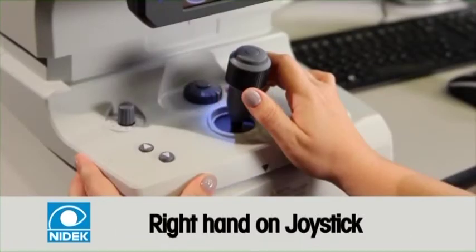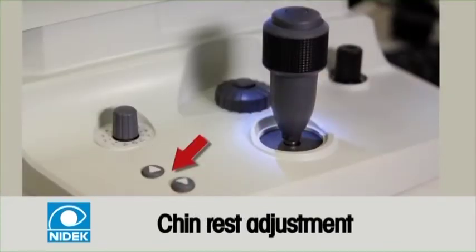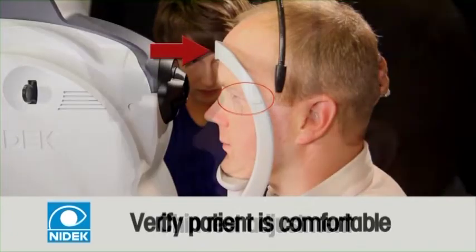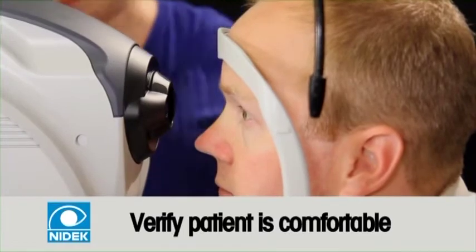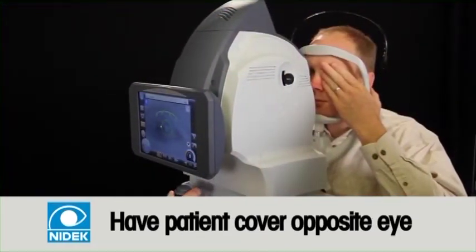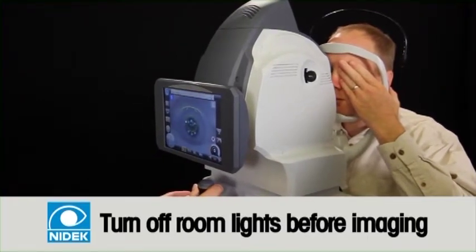Place the operator's right hand on the joystick and left hand on the left side of the base. Using the buttons on the joystick panel, adjust chin rest height so the lateral canthus is lined up with the notches on the headrest. Confirm the patient is comfortable. Have the patient cover their opposite eye with their hand. This will help them better fixate on the target. Turn the room lights completely out before capturing any image.